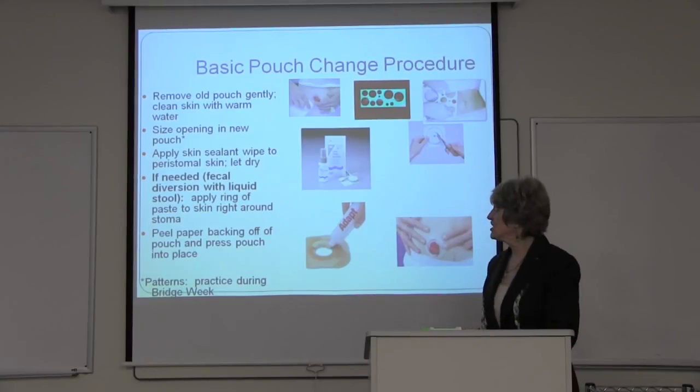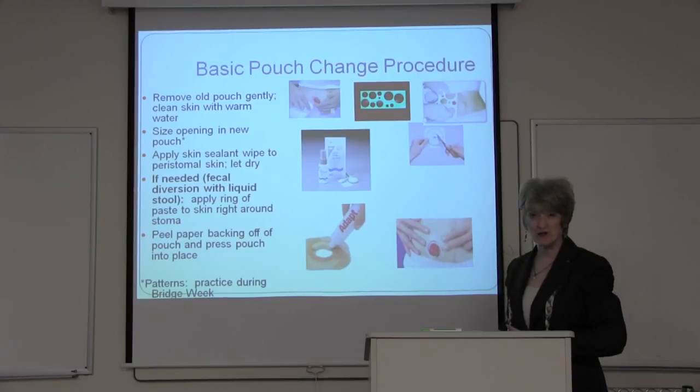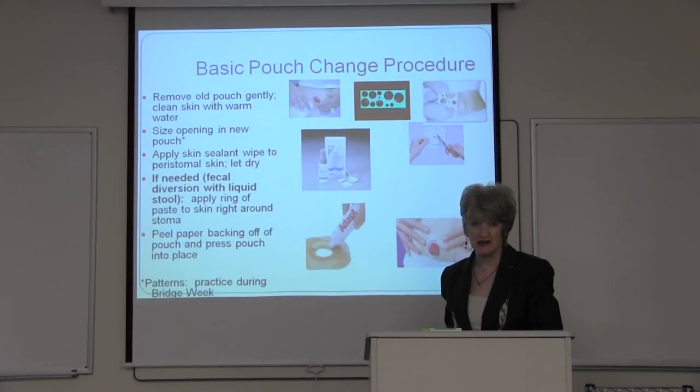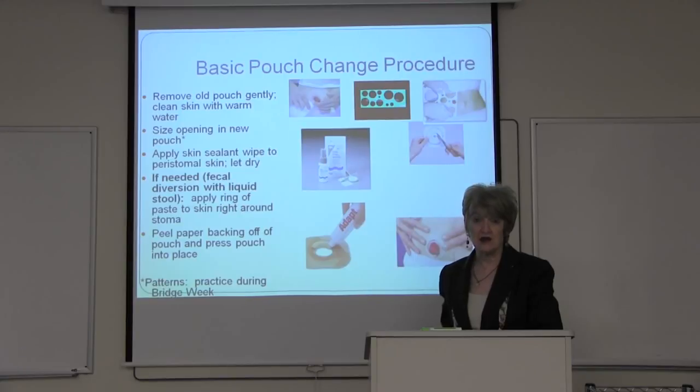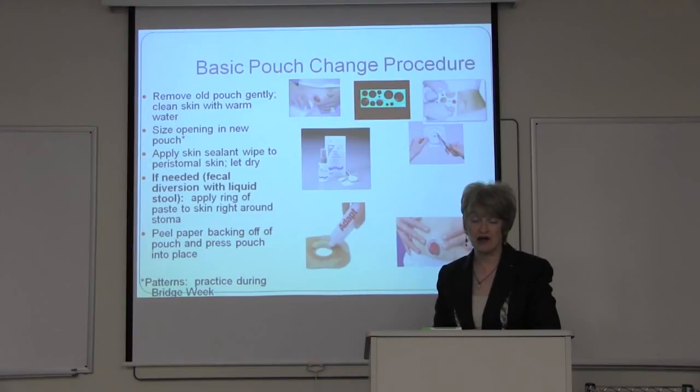Now, basic pouch change procedure that I want to go over with you, you want to keep it very, very simple. I remember having some patients who had some cognitive impairment, and for those patients, I put them in a one-piece pouch that was pre-cut. And I literally got it down to the point where I said, take off the old pouch, wash your skin, wipe your skin with this clear protective wipe, stick on the new pouch. You want to keep it as simple as possible.